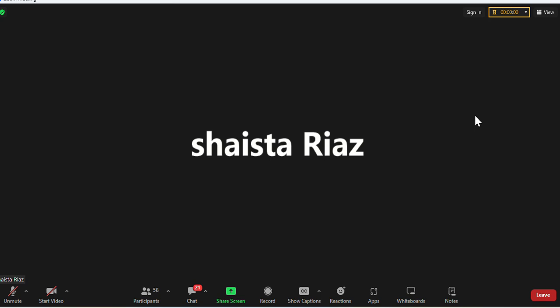And the one we're looking at, let me pull that up again. Okay, so here we have this. Ma'am, we can't see the screen. I'm going to share. Just give me a minute. I'm just loading the images again. Sorry.